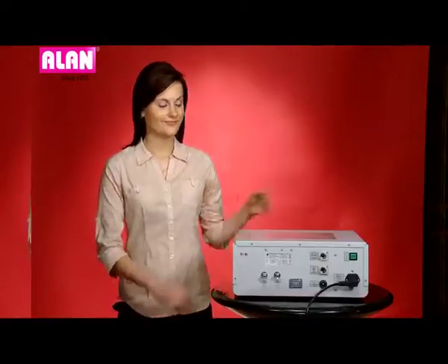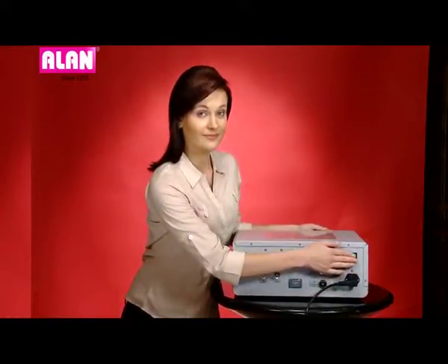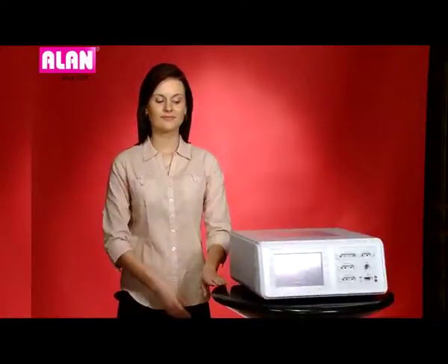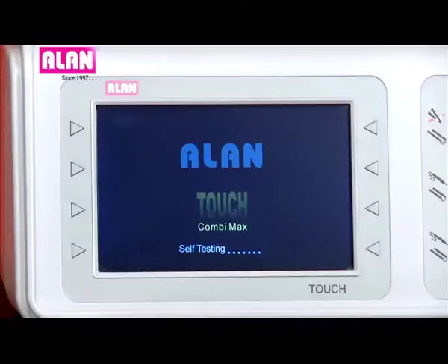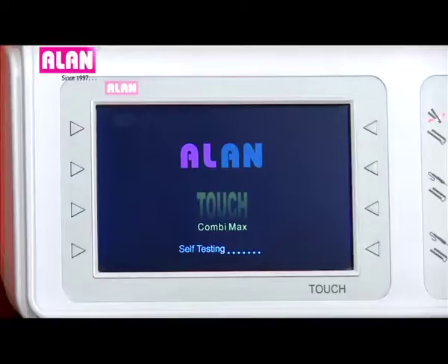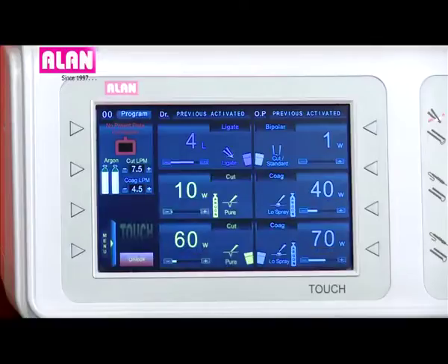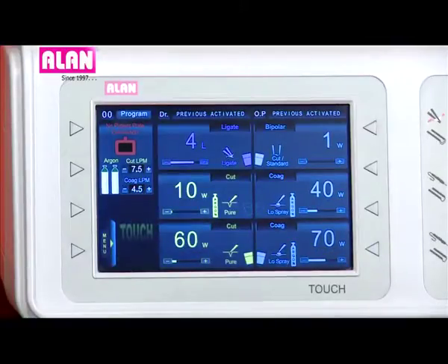Now let's turn on the unit. During startup, the unit does a self-test to ensure proper functioning. If the self-test is successful, it proceeds further; otherwise it shows an error message.